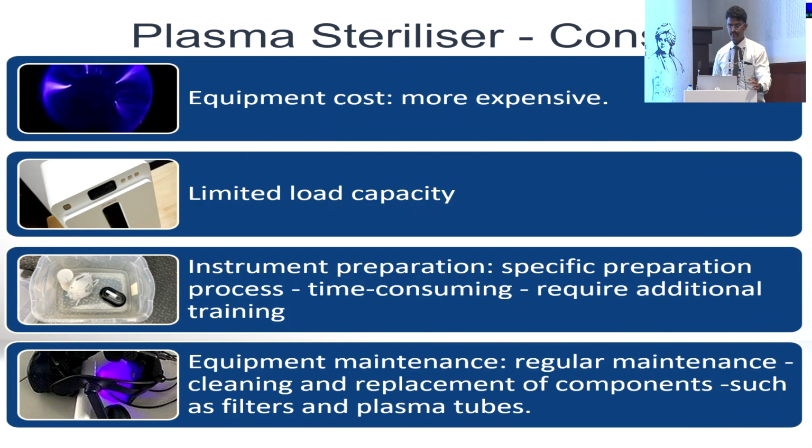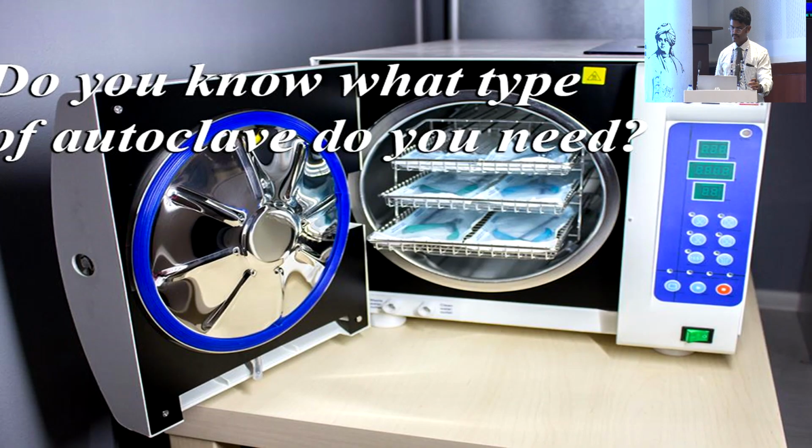But what are the difficulties here? There is limited load capacity, instrument preparation is quite tedious, and lastly the maintenance is quite heavy. It requires regular maintenance and cleaning for plasma sterilization.